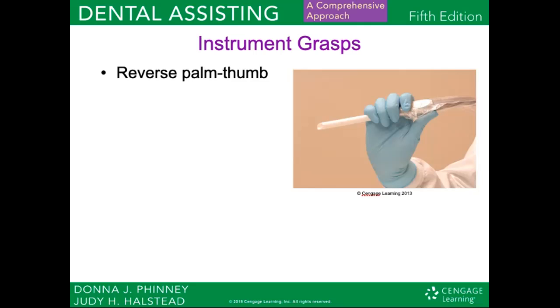Failure to master these basic skills may result in injury to the patient, the dentist, or the dental assistant, and or loss of production for the office. Okay, so it's going to be very important to study all of these pen grasps, all these instrument grasps, and know how to hold every instrument. And we'll go over more of this stuff in lab as well.